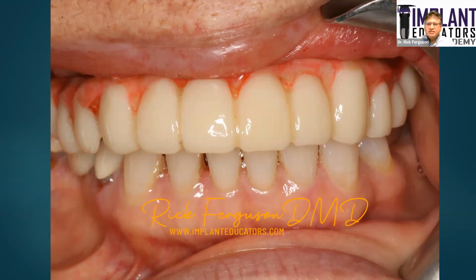In my course, I teach how to design these and how to make them so that they last. There's certain parameters that you have to follow, such as having enough material around each of those holes, etc. And then also one thing that we're doing is, if you have the access to photogrammetry, we're actually able to print these now after the implants are in. So you can take a photogrammetry scan of the actual implant positions, have the design already done, and then recreate the intaglio, attaching it directly to the actual implant positions, which then you don't have to do the pickup part of it.